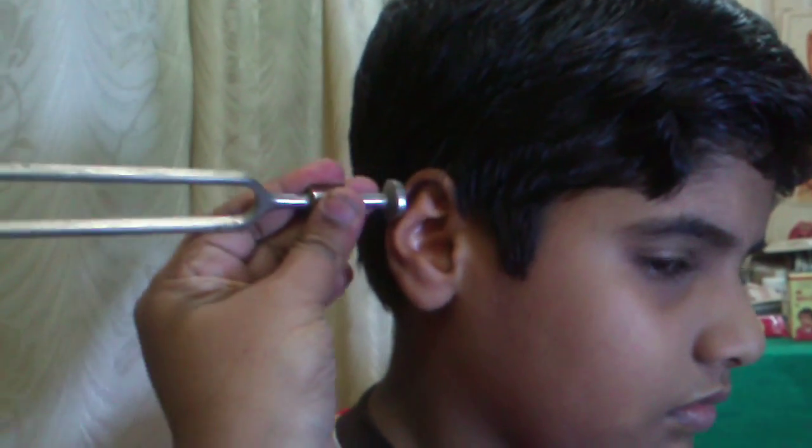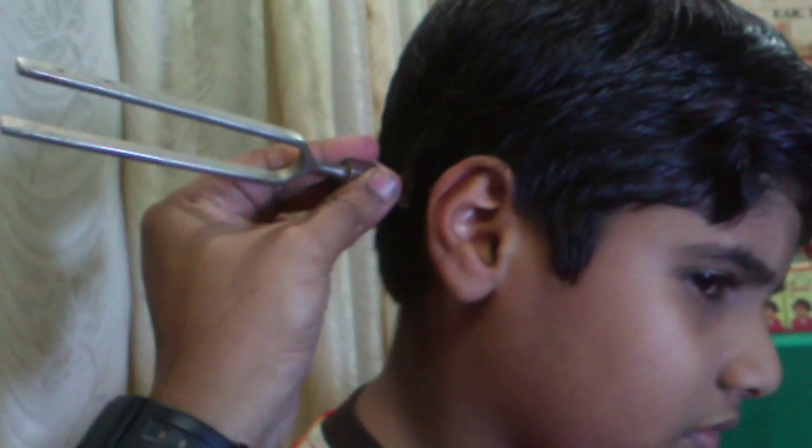The Rinne test is performed by vibrating a tuning fork by tapping it on the knee, then asking the patient which they hear better — either here in the external canal or on the bone.